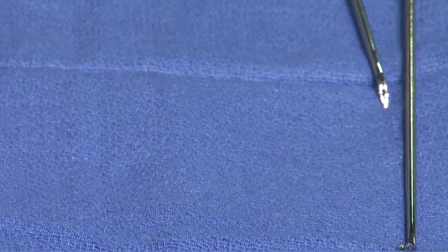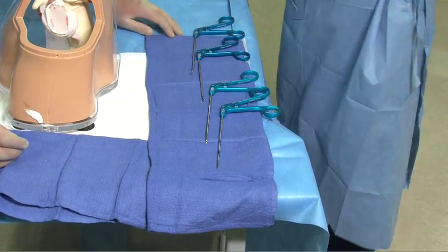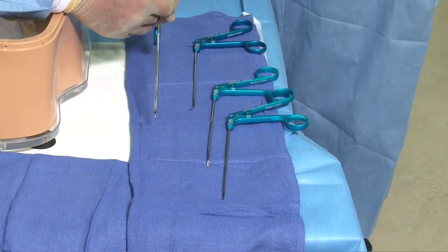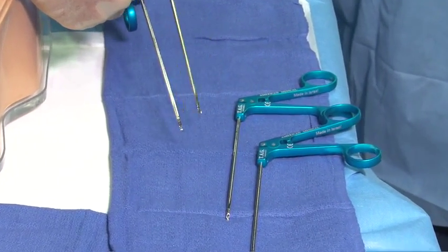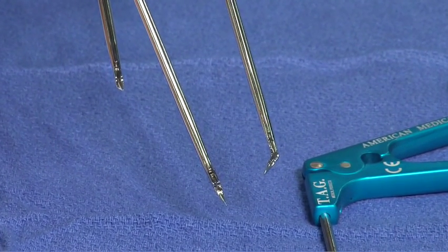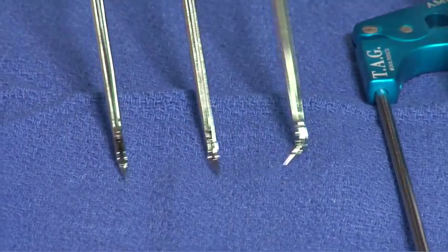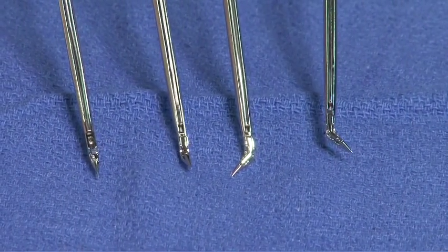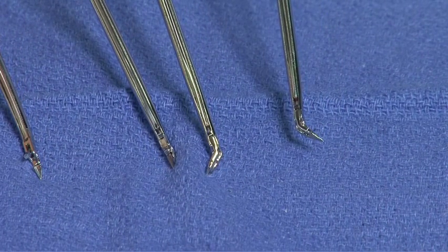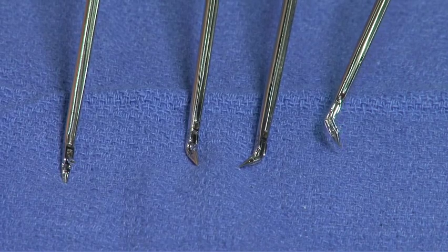When we move to the penetrating graspers, we see that the four penetrating graspers have either a straight tip, an angled tip, or a right-side and left-side angle of the tips. Focusing on the angles of the tips, we can see how each device is machined just appropriately to allow for the suture to be grasped and the tissue to be penetrated regardless of position or portal.